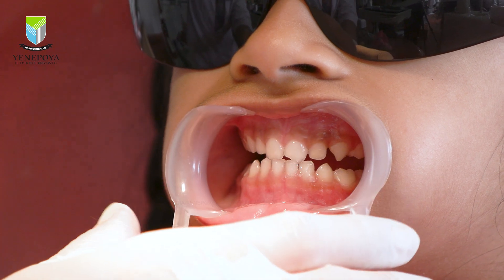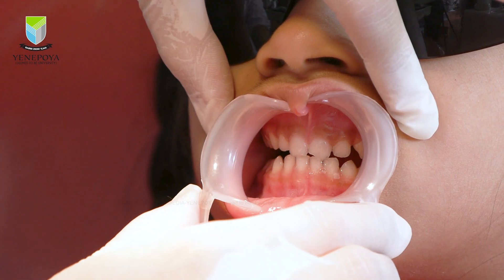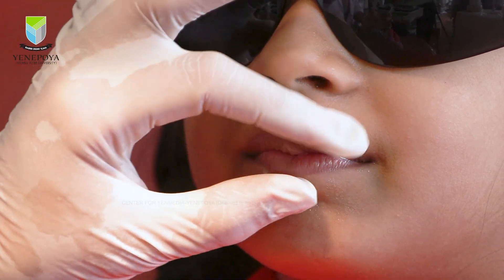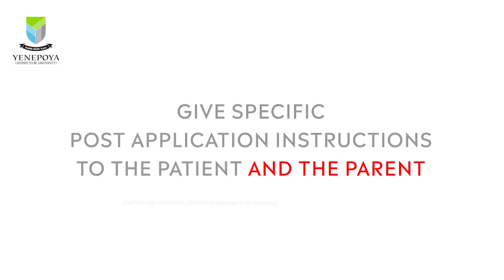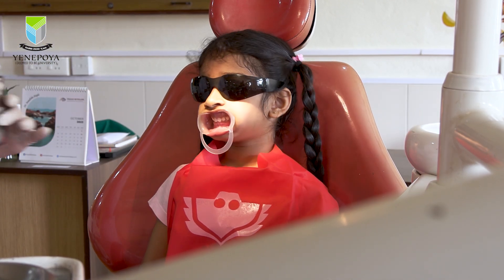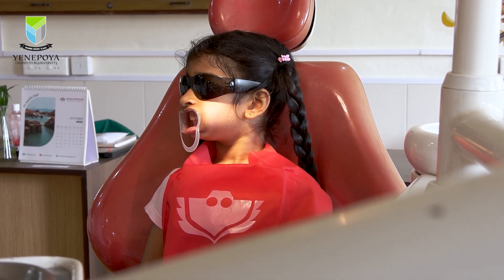Once the application is complete, ask the patient to slowly close the mouth and the saliva will help the varnish harden on the teeth. Remember to give specific post-application instructions to the patient: it is generally recommended that the patient waits for half an hour before eating or drinking anything post application.